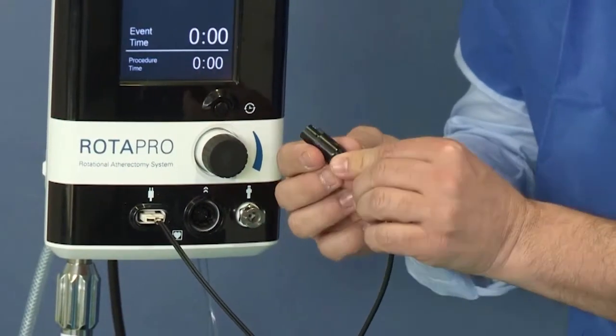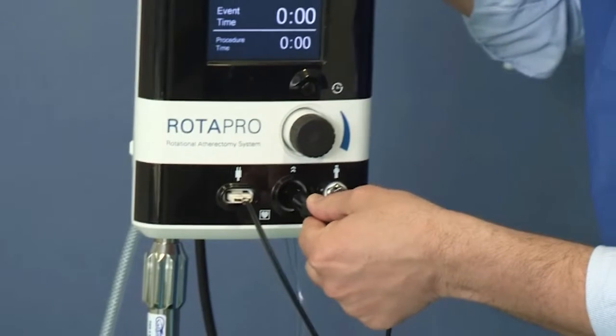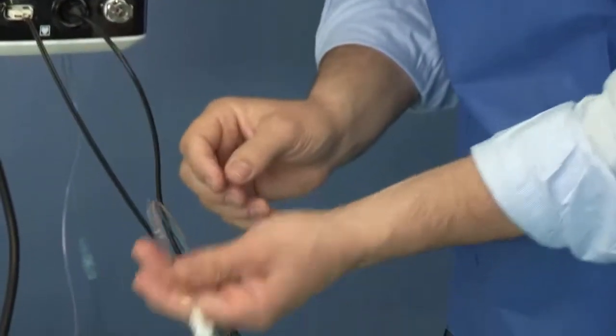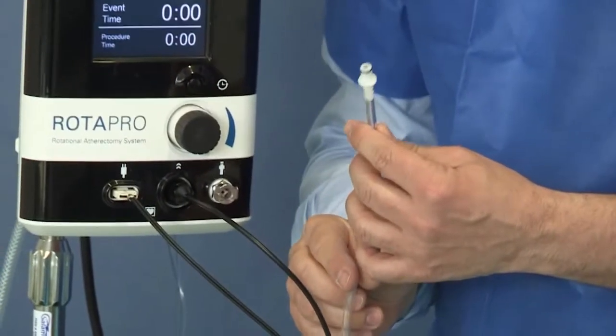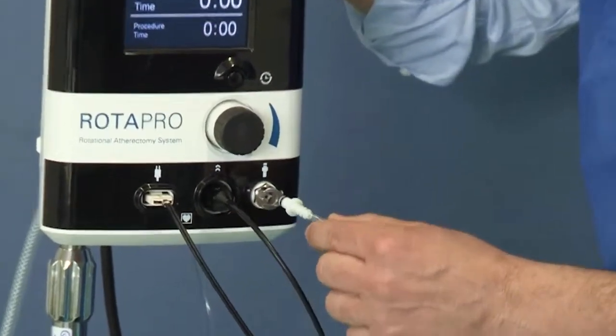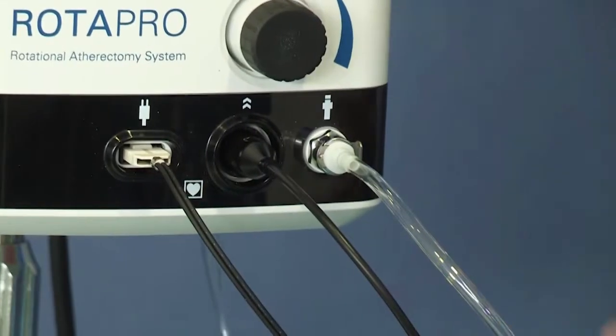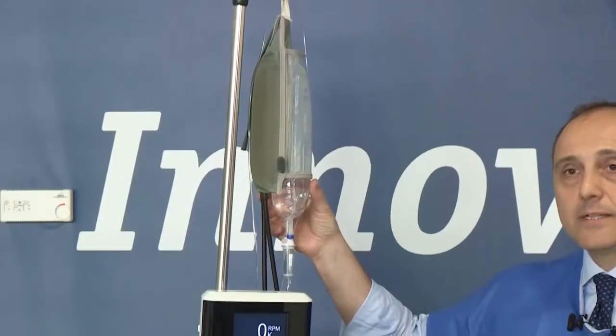Normally there is an arrow here, so arrow to arrow. That is done. And as a third, we have the pneumatic tube where gas is passing by. That is connected at this level. Now all the connections are done. We are ready to do the last connection, which is the connection with the cocktail.